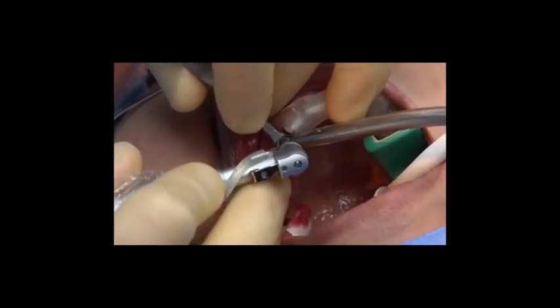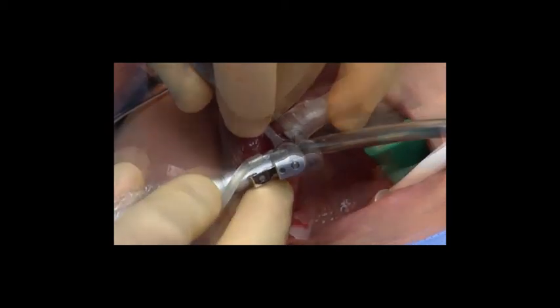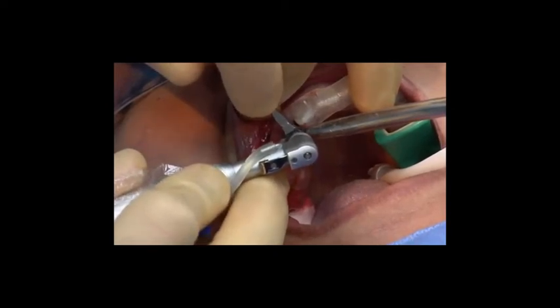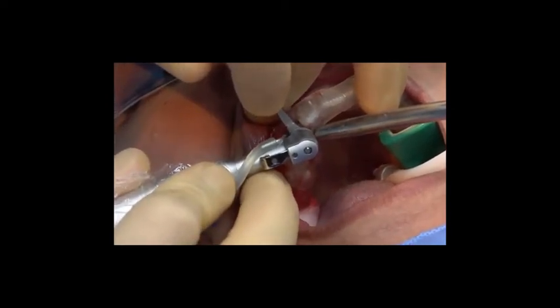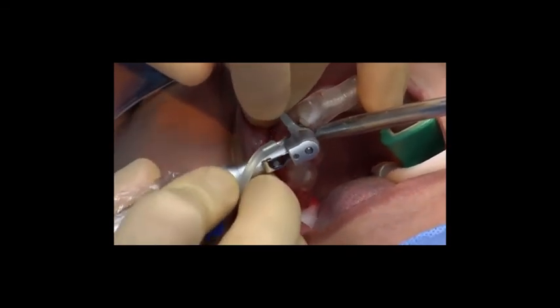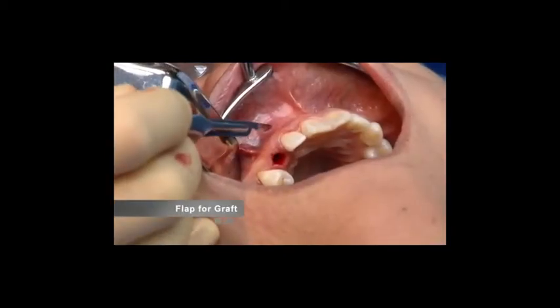This is pretty standard. Just make sure when you do this, you do a very nice slow pumping motion up and down, and then also in between the osteotomies, take the guide off, and then you and your assistant make sure you rinse the site out thoroughly with chilled saline solution. That way you avoid overheating the bone, which can be detrimental.